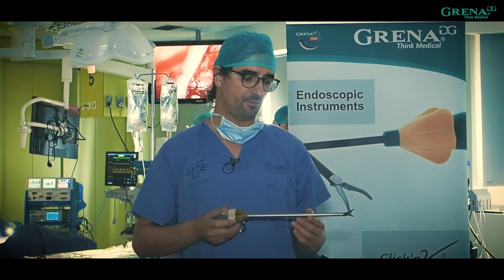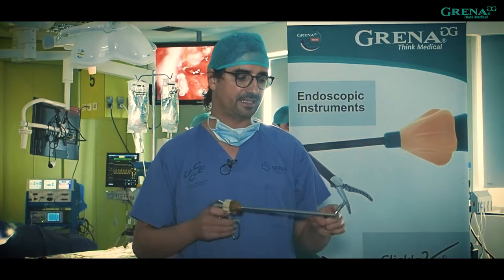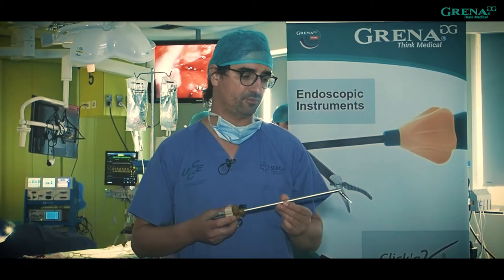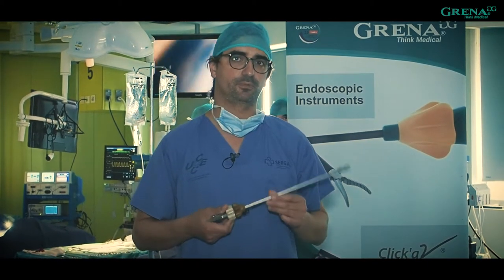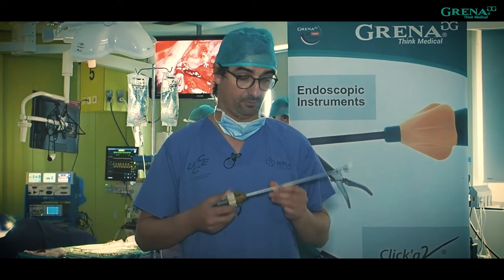Thanks to this articulation that angulates almost 90 degrees, you can see clearly even at the most difficult angles through uniportal VATS. So for this kind of operation and uniportal technique, this is really important — it will improve and make the surgery easier for many procedures.